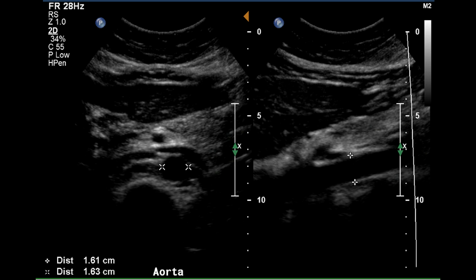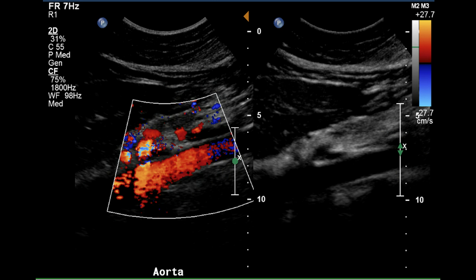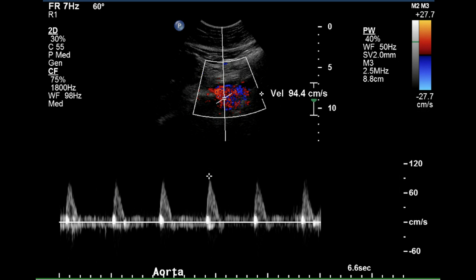This is a dual image, grayscale, demonstrating a normal aorta at the region of the renal artery origins. This demonstrates complete filling of the aorta with color flow, indicating the lack of disease in this area. Pulse Doppler of the aorta indicates the peak systolic velocity is 94.4 centimeters per second.